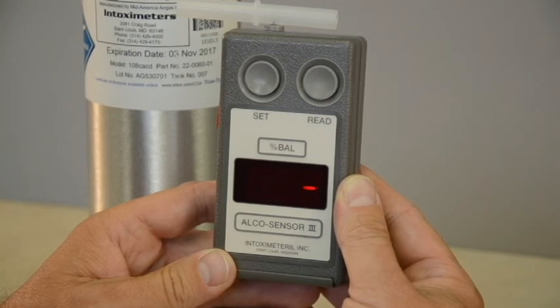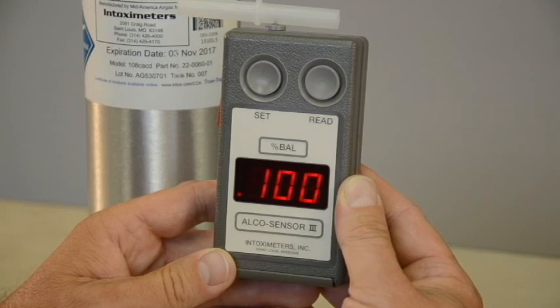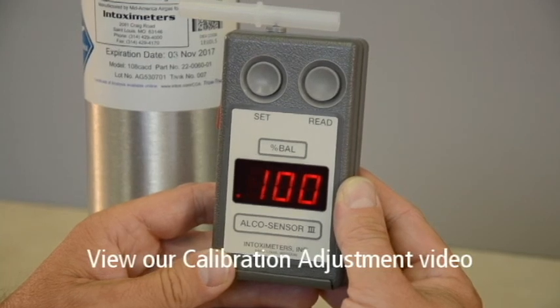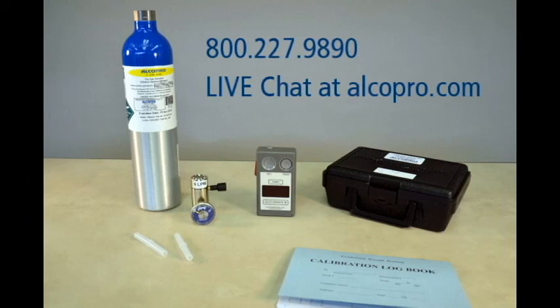If the result of your accuracy check falls outside of the acceptable tolerance range, you must take the instrument out of service and perform a calibration adjustment to bring the instrument back into an acceptable tolerance range. You can view our Alkosensor 3 calibration adjustment video for step-by-step instructions. If you need technical support or repairs on your Alkosensor breath alcohol instrument, contact one of our factory trained technicians at 1-800-227-9890 or through live chat at alkopro.com.